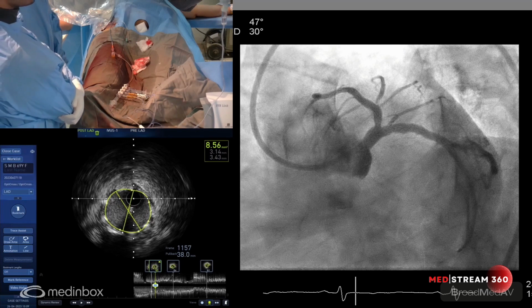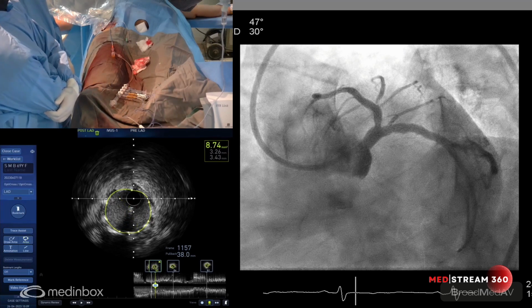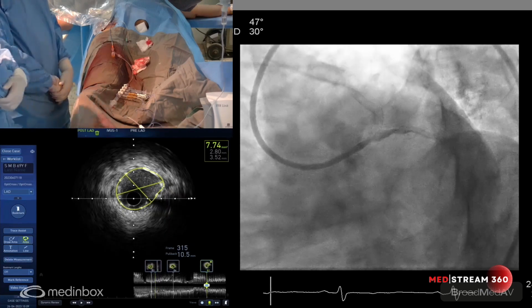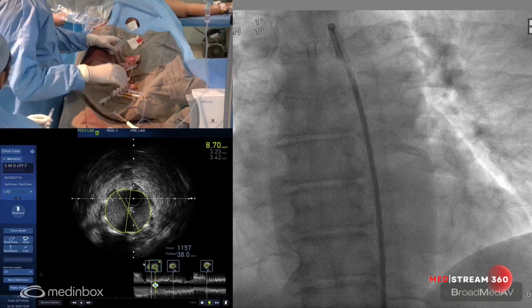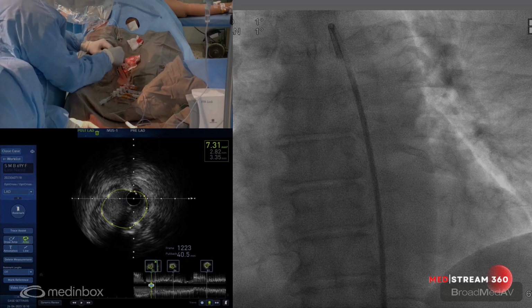So I'm pretty happy with this result. And Ashish, are you okay with the whole thing? Yes, sir. So the stent expansion is good. Diagonal is flowing. There's not much of ECG changes. No, the patient is not having any discomfort. So thank you very much. And I thank all my sisters and techs at MMM and Ashish and Rahul for the case. Thank you.